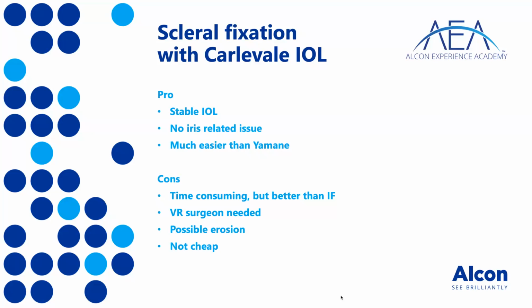Now, this Carlevale lens has been around only for a few years. I think it's 2-3 years, something like that, probably 4. So we really don't have long-term follow-up.